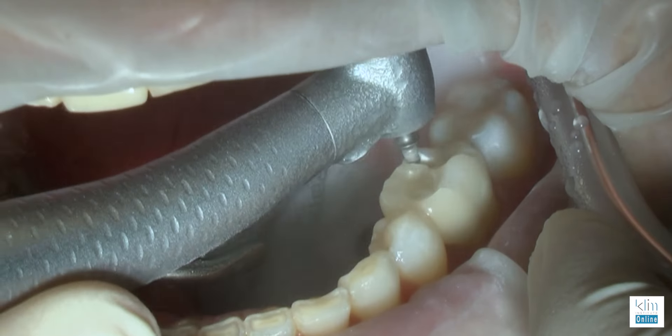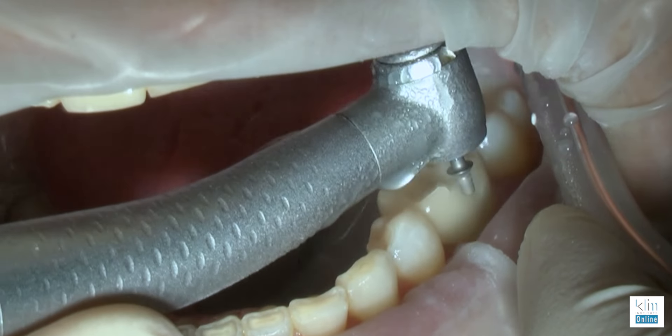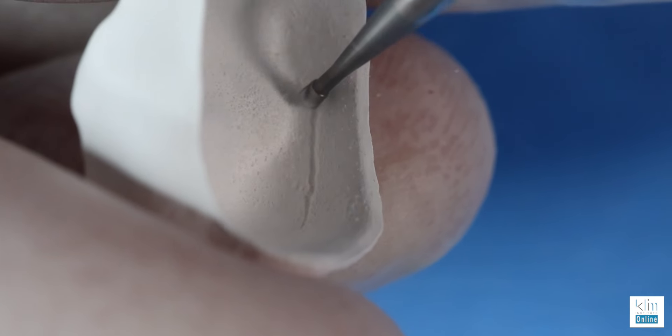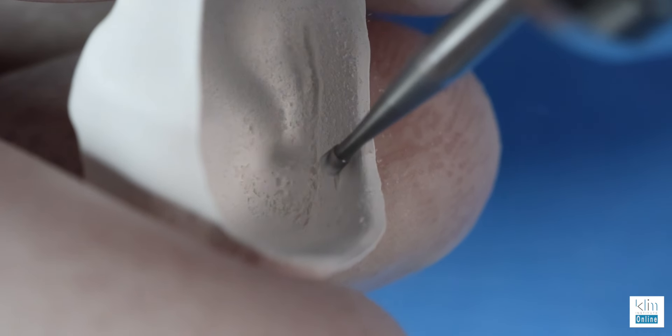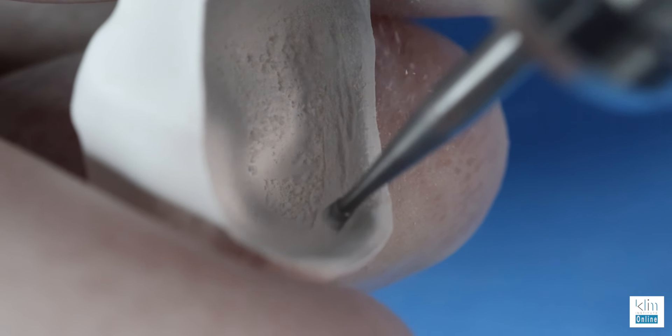I have not been a fan of bonding in zirconia, even though Kuraray wanted us to do that with their first phase of zirconia because it's a 5Y. I've been cementing those with resin glass ionomer ever since I placed them. I like Katana zirconia as well, and I've never had a problem with them fracturing. The secret is just making sure you get enough occlusal clearance, paying attention to the engineering dimensions recommended by the company for a 5Y zirconia. I provide some internal undercuts before cementing with an inverted cone, and sandblast the restoration really well.